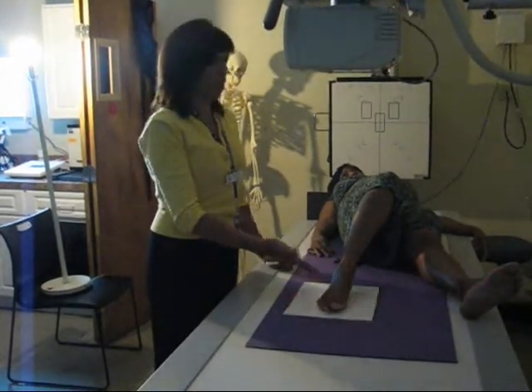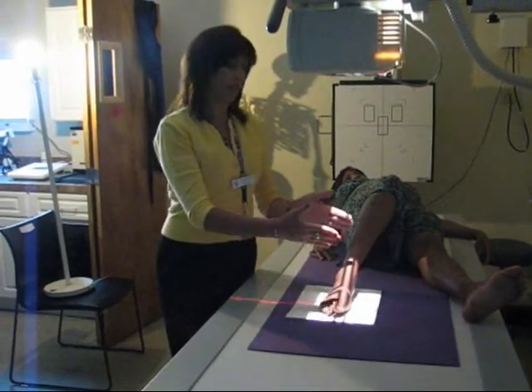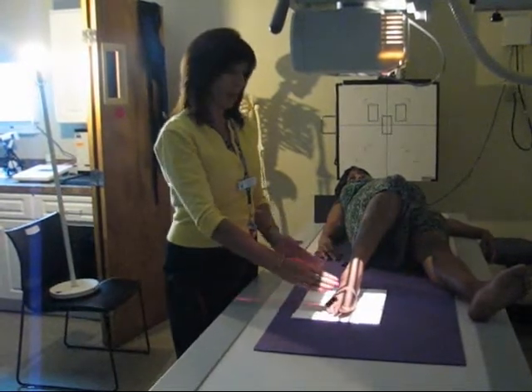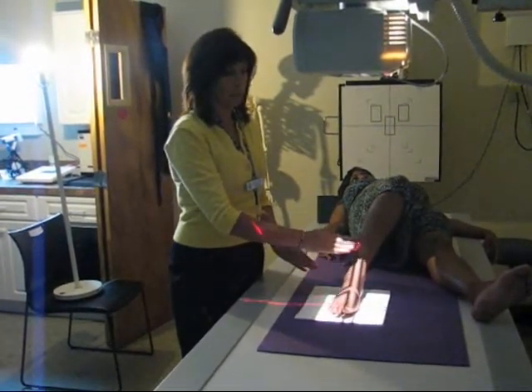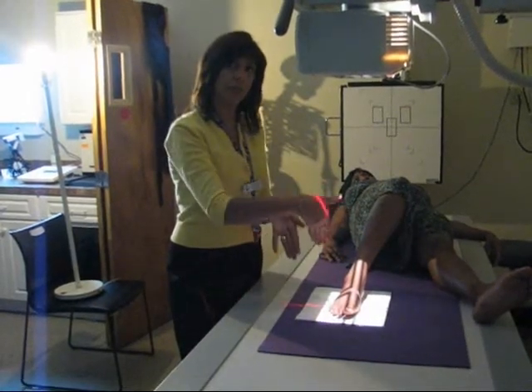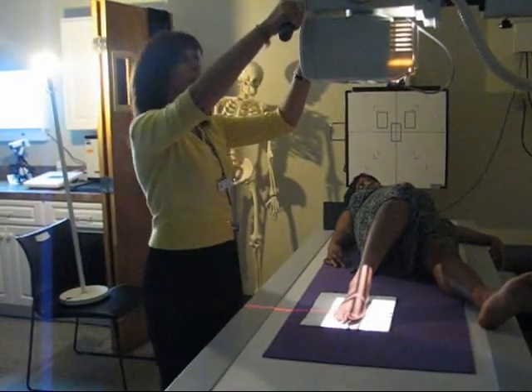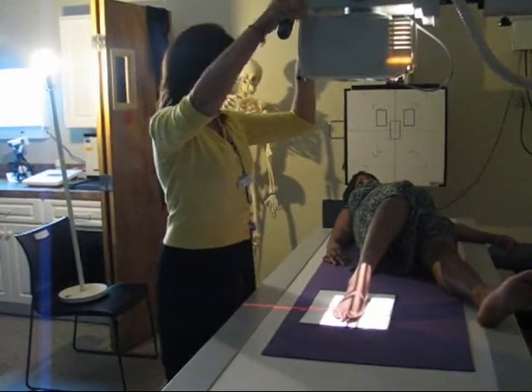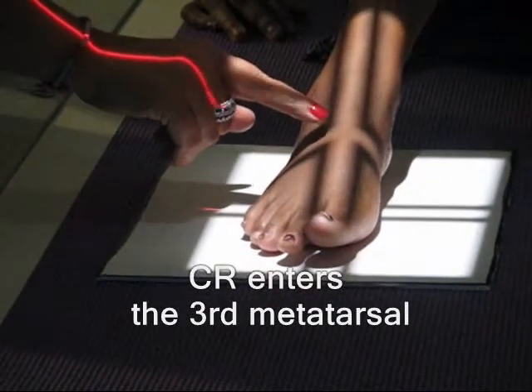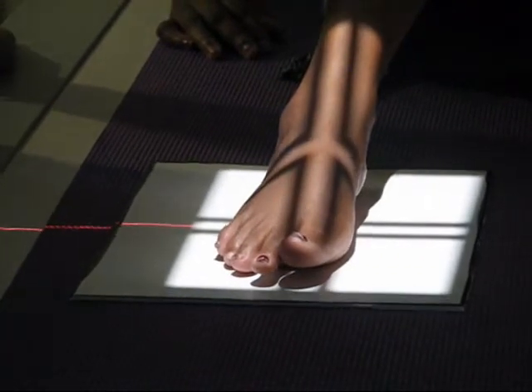So you want to compensate for that, and you also want to be able to see all the open spaces in between on the joints. You have to angle the tube in order to enter the spaces in between the joints, which is what you want to visualize. The central ray is on the third metatarsal.